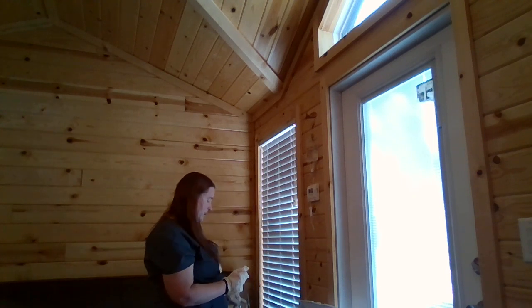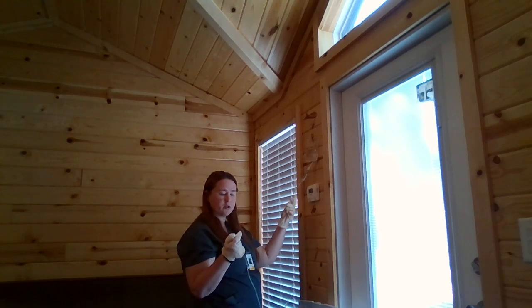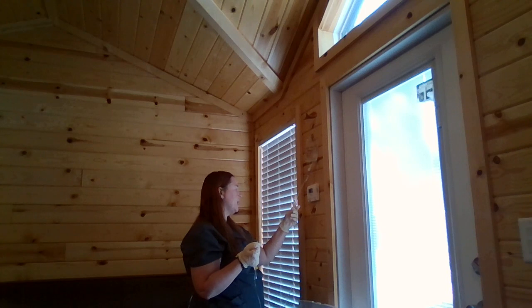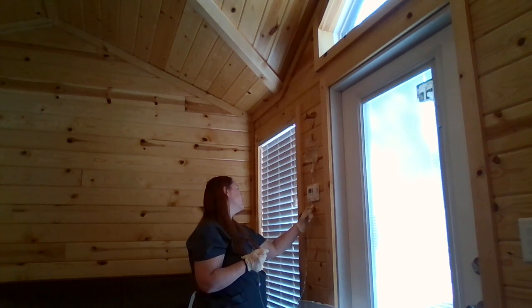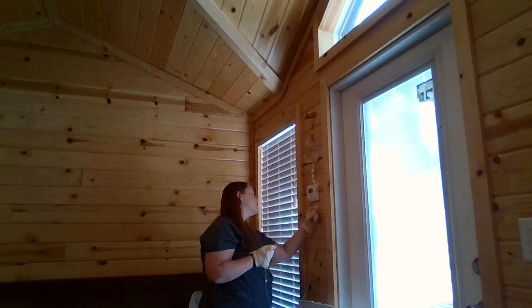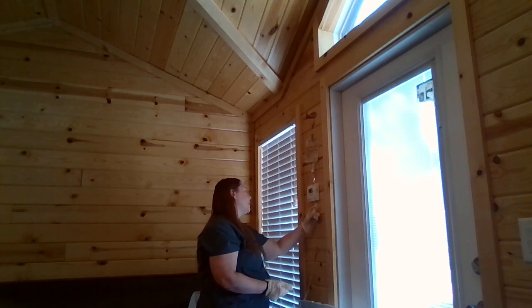So I have a timer here. What's going to help me calculate my drops per minute is my roller clamp. So I will just unclamp that till we have drops dropping. Now I will count.